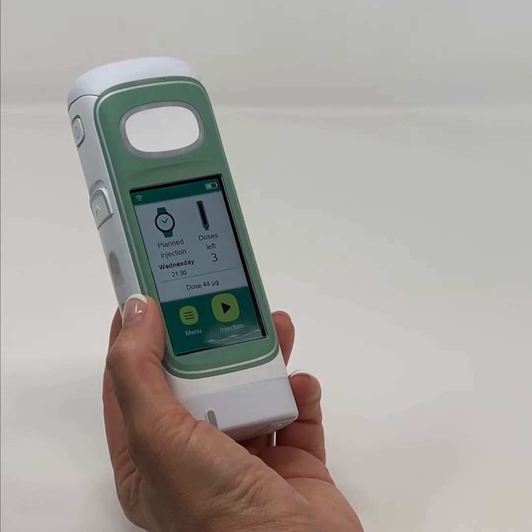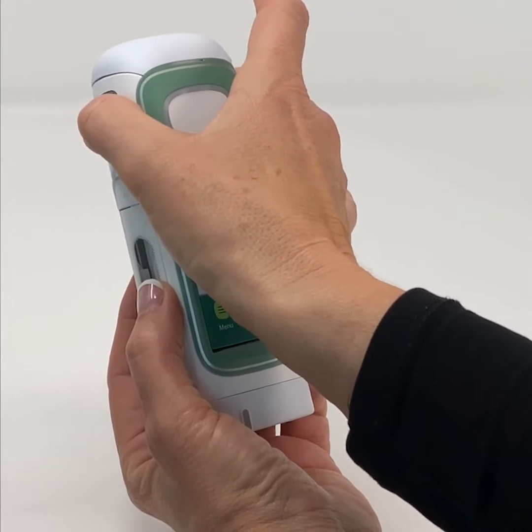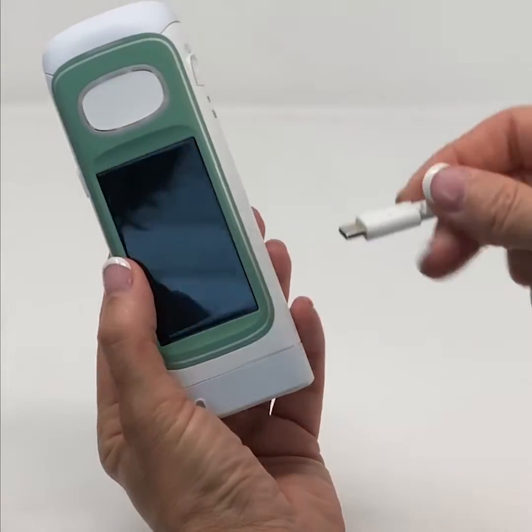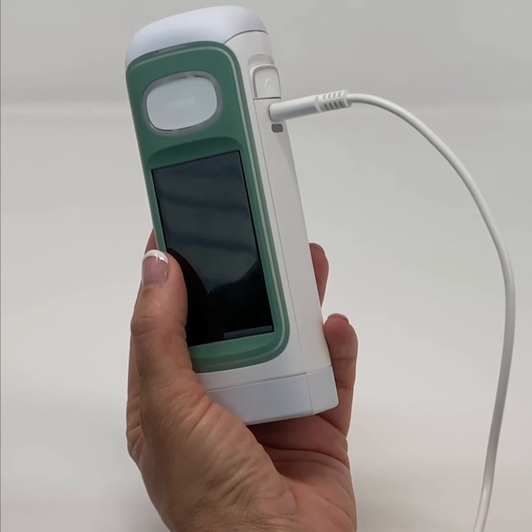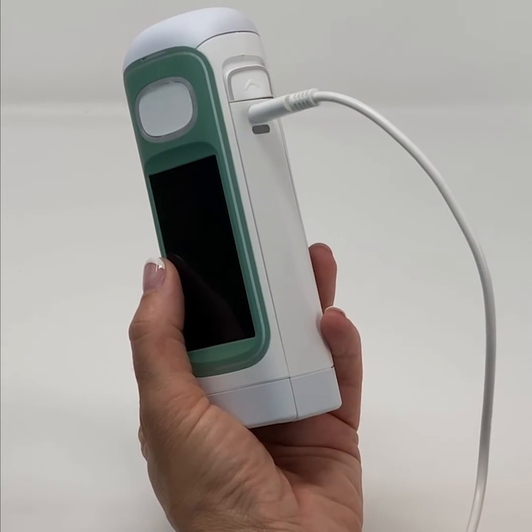Confirm the battery is fully charged before using the device for the first time. Fully charging the battery will take about two and a half hours. A fully charged battery can power the device for about 30 days. The battery level is displayed at the top of the home screen.